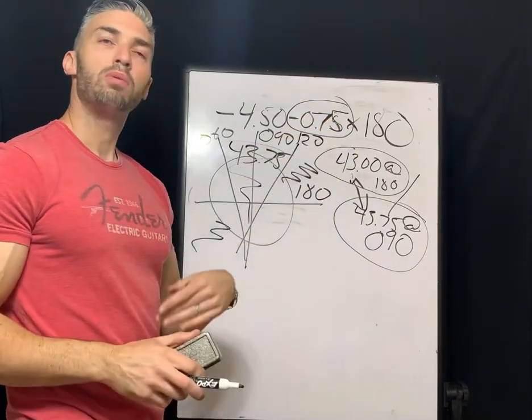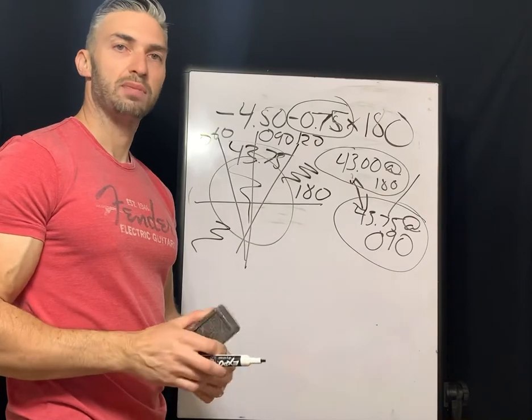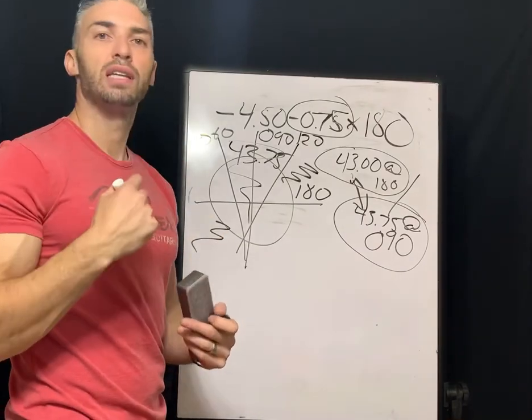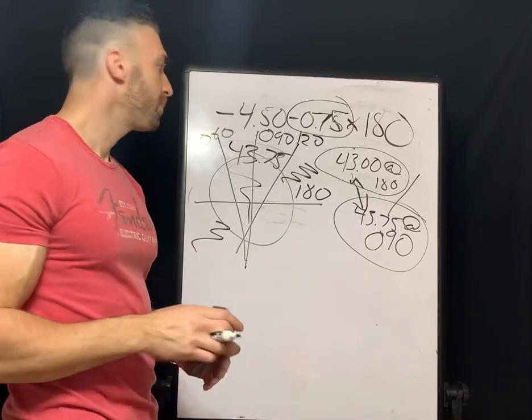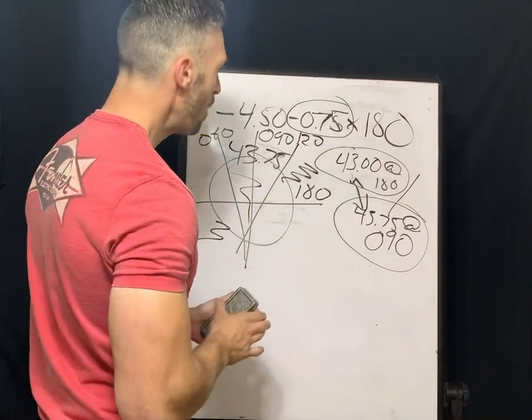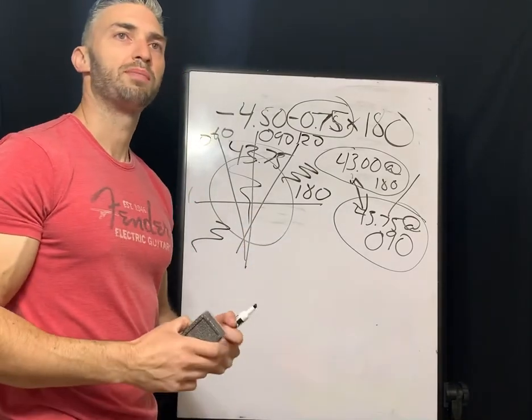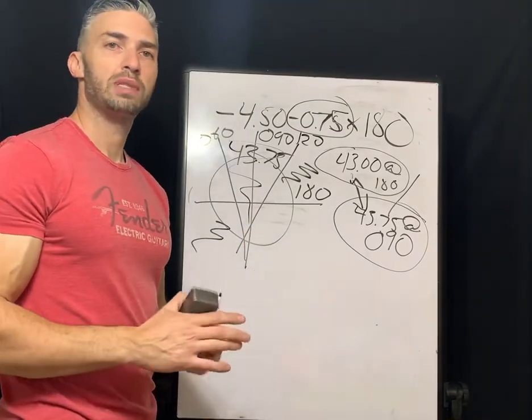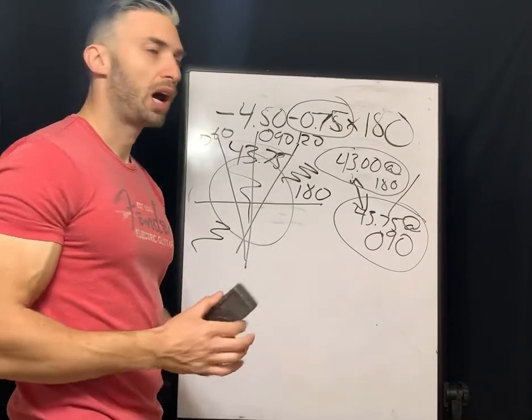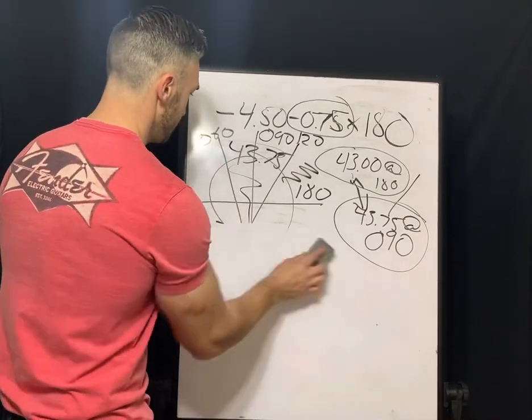So what we can see right off the bat is that the corneal astigmatism matches your total astigmatism, right? So there's probably not any lenticular astigmatism, which is astigmatism from the crystalline lens inside the eye. So we could tell that it's all corneal astigmatism, and that it's with the rule astigmatism. And we know that with the rule astigmatism, you can use a gas permeable lens to correct up to 3 diopters of with the rule astigmatism.